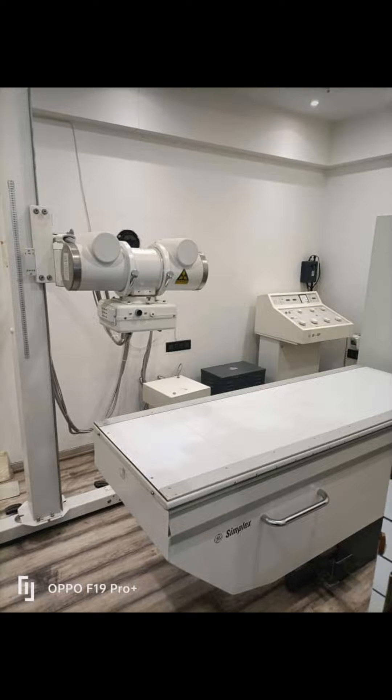Hello friends, today I am going to tell you about the power supply requirement for the 500 AMG low frequency X-ray machine.